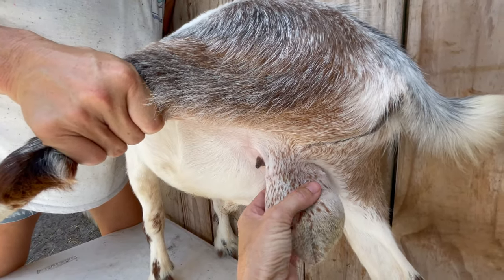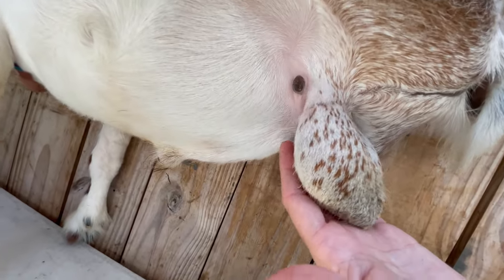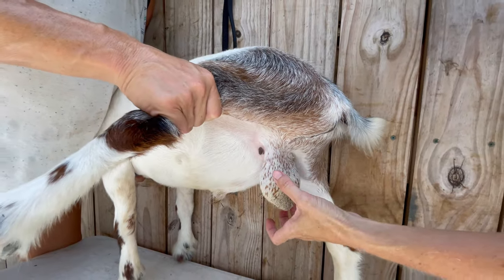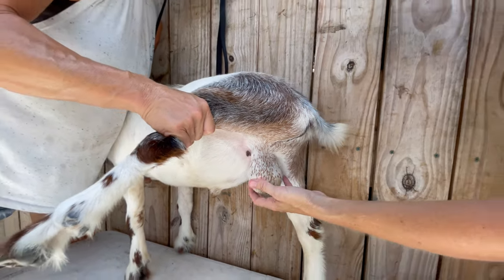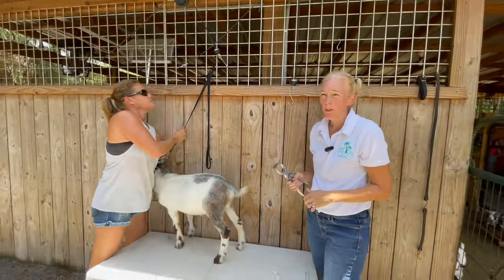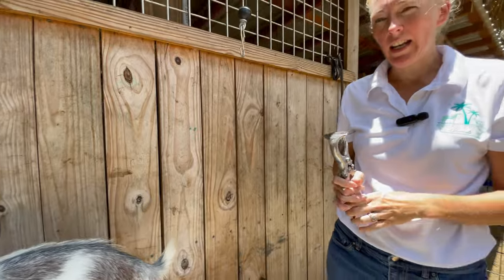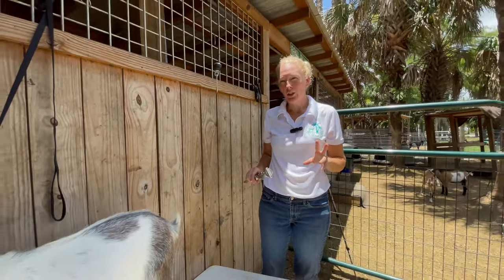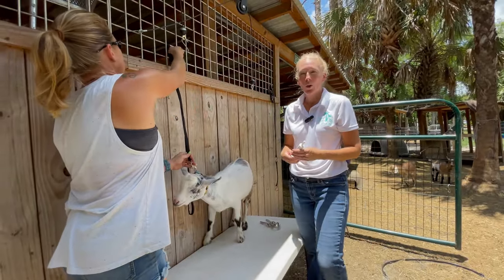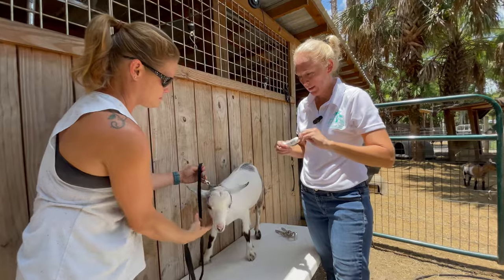You can see we've got our staggered clamp areas, below the teeth, where the cords have been pinched. We're taking note of the size of his testicles right now, and Mary — his owner — is going to watch and make sure both are shrinking over the next few weeks, not one getting bigger and one getting smaller. I'm confident we got a good clamp on him, but if you notice one side getting bigger you need to redo that side. It can take two weeks to a month for the testosterone to fully leave his system.